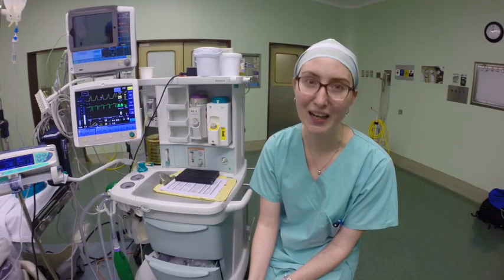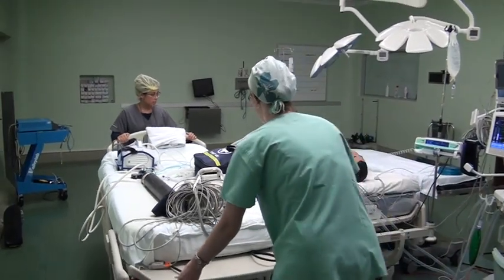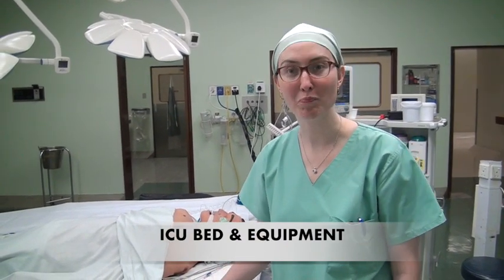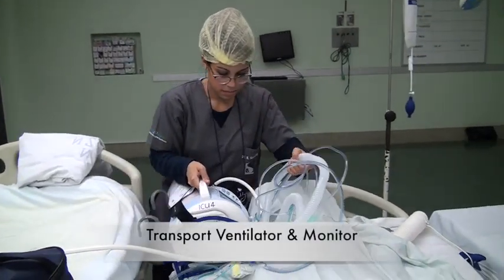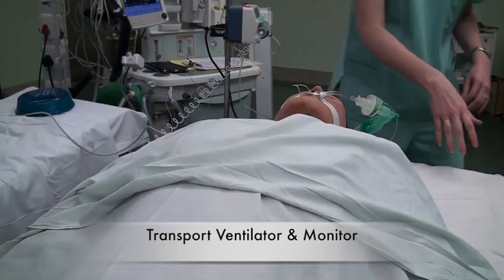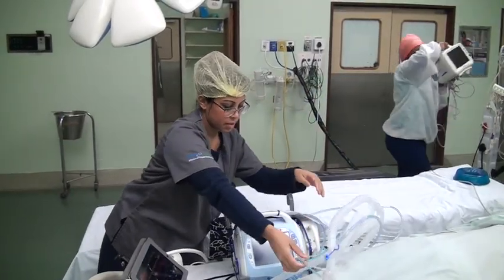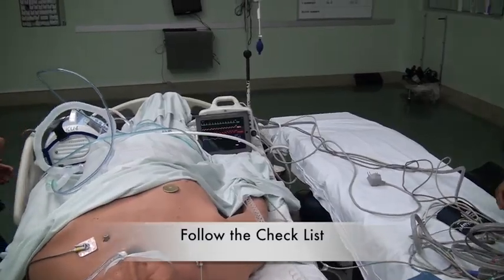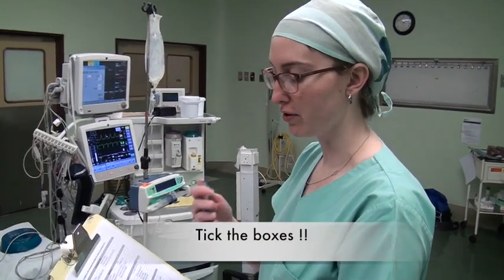The protocol is a guideline to be followed but it can be overridden by any ICU or anaesthetic consultant. We've now brought our ICU bed with all of the equipment into theatre and we have to make sure that the patient is ready for transfer. We'll get our transport monitor on the patient, set up our ventilator, and make sure the patient is stable. At this stage it's very important to follow your checklist to make sure you don't miss anything — you must put a tick next to each thing you have done.